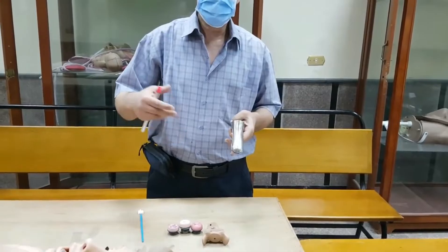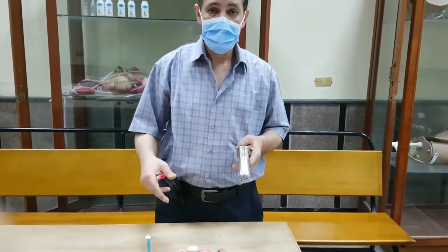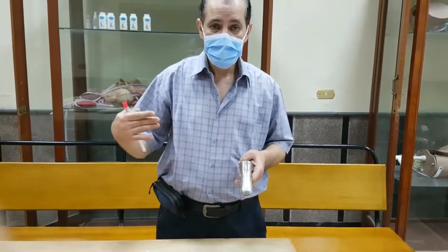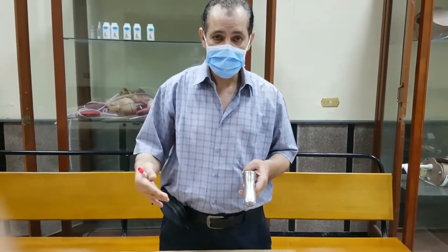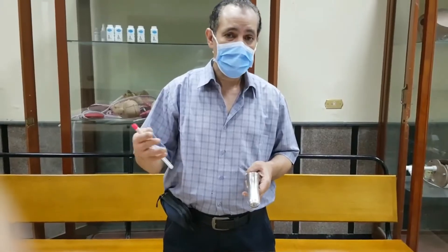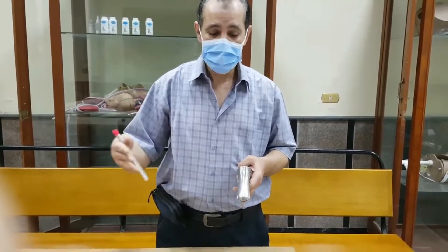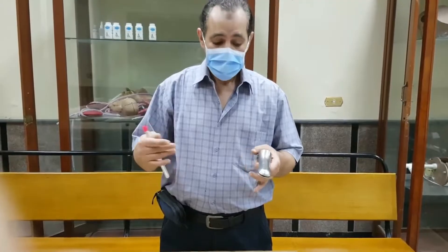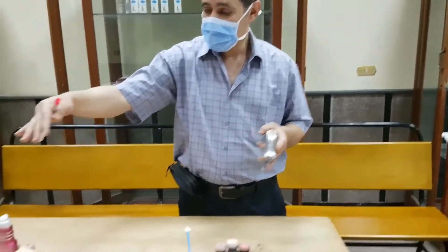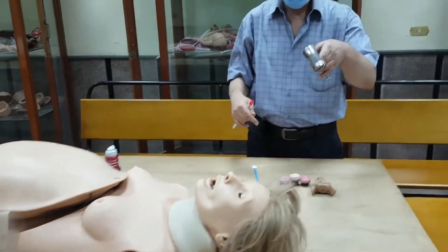I want to ask the patient for certain precautions before she comes for the swab: no intercourse in the previous three days, no vaginal douche in the previous three days, no intravaginal suppository, antifungal or antibiotics, and so on. So she is ready right now, like this case, in the lithotomy position, and I do a speculum examination.